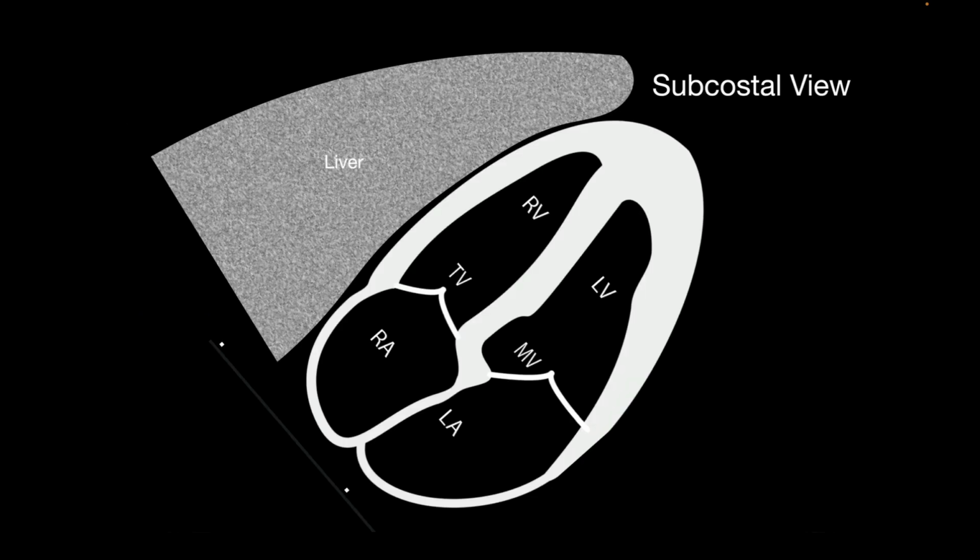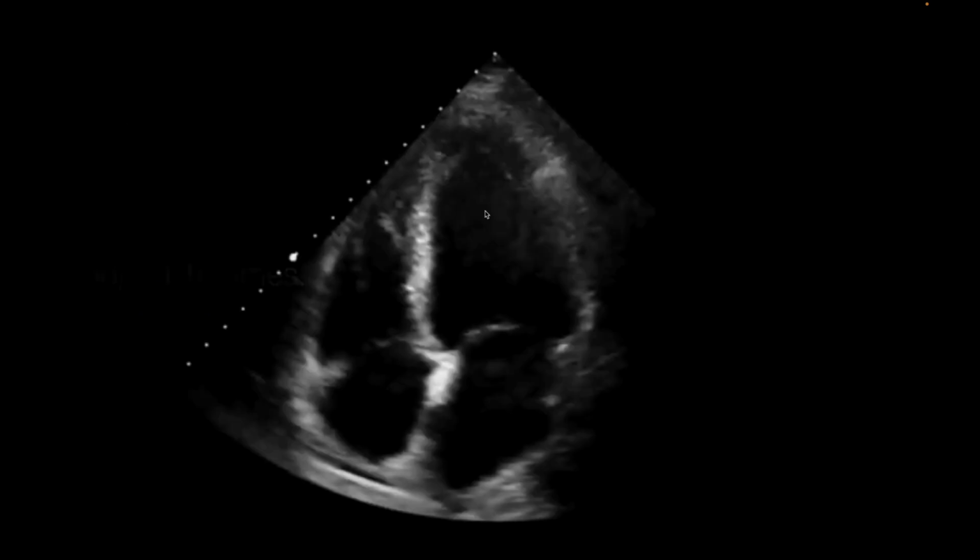And so this is a good view for looking at those 2 different ventricles, comparing the sizes of all the chambers. You can also see effusions on this, and it's quite good for looking for pulmonary hypertension, where you may see the septum bending in towards the left ventricle.